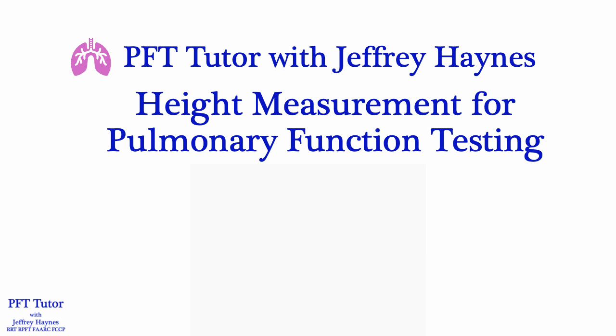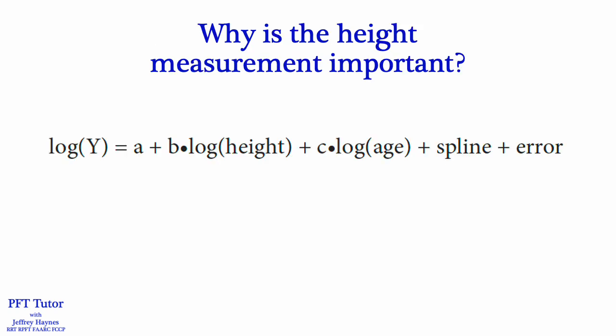In this video, we're going to discuss a topic that doesn't get enough attention: how to properly measure height prior to pulmonary function testing, and how we ensure that the device we use to measure height is accurate. Height is an important demographic to measure because it is used along with age and born sex in reference equations to establish normal ranges for your patient.